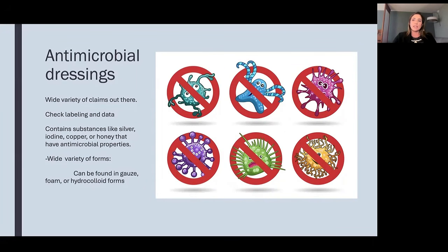Just as a large caution, antimicrobial dressings are great. We obviously know microbes are a big issue in wound care. But there's a wide variety of claims out there. And some of our antimicrobial dressings can be doing nothing for addressing the bacteria that's actually within the wound.